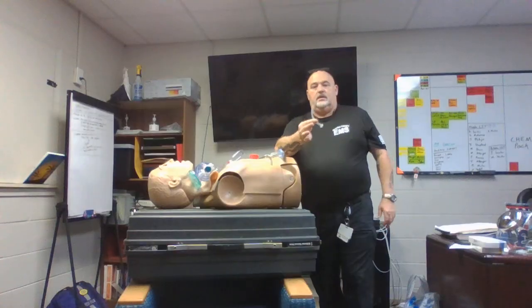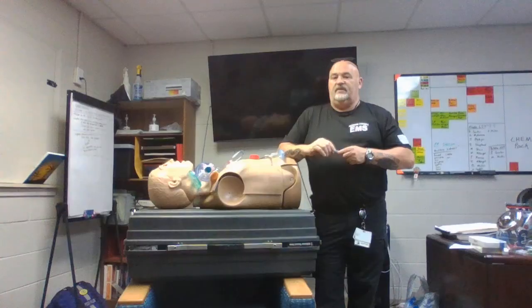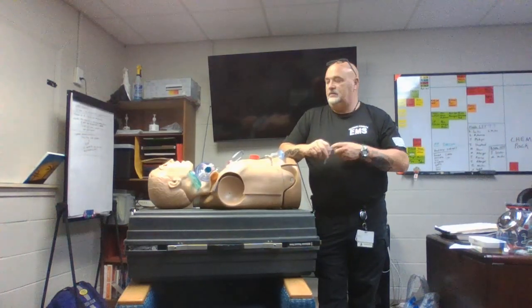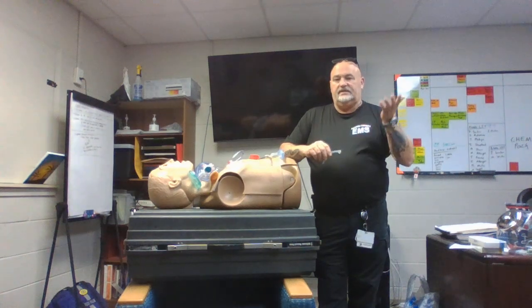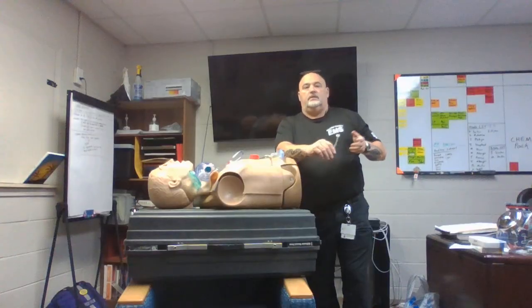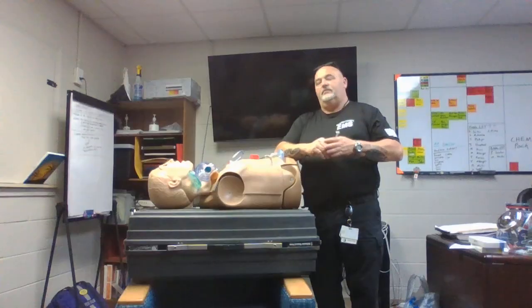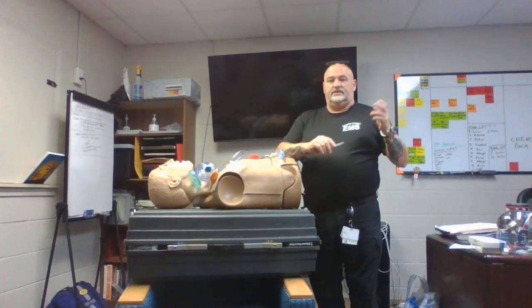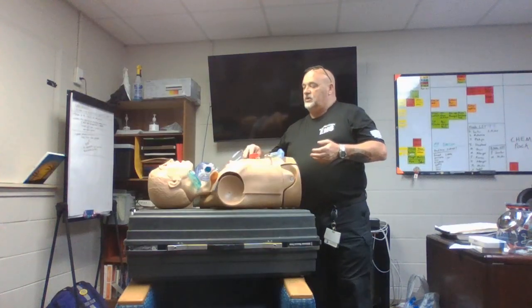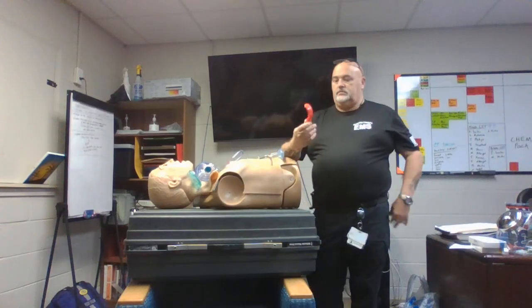NPAs, right? Commonly used. I don't know about you guys, but a lot of our people use them for overdoses. They'll pop these in, start bagging them up, get that sat up, give them a little bit of Narcan to offset the opioid to get that respiratory drive back up, which gets the sat back up. So everything is intertwined. Go back to this. Indications, right?